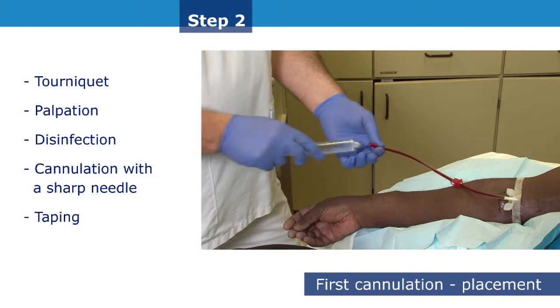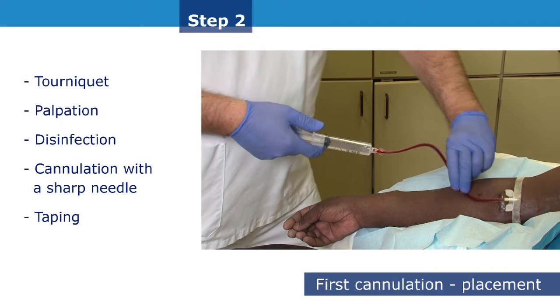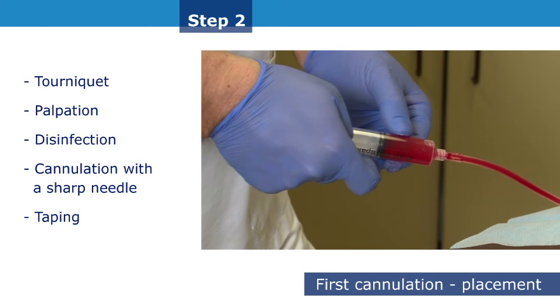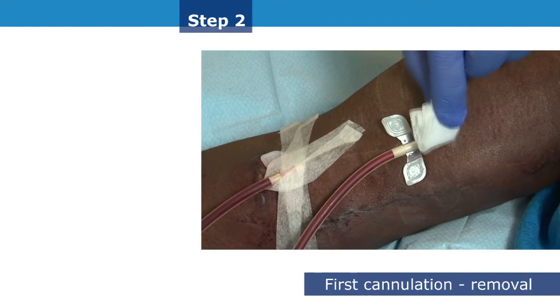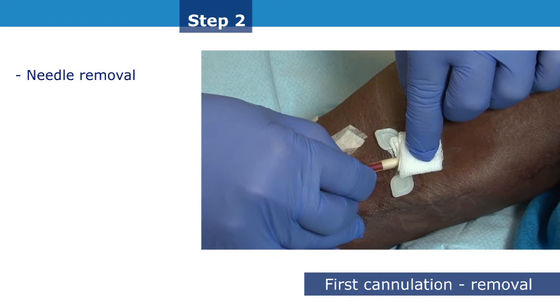Tape the needle and check for any flashback of blood. It is essential that cannulation site selection and the first cannulation be performed by experienced practitioners, as the success of the technique depends on it. After the first session, needle removal should be performed at the same angle as the insertion angle.